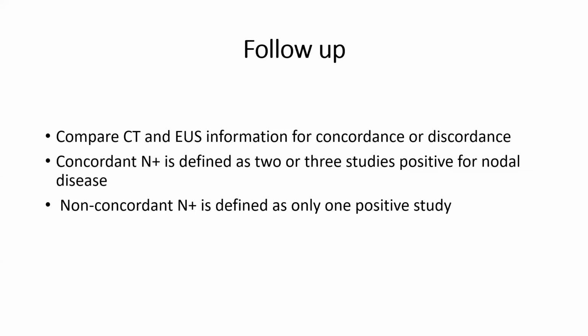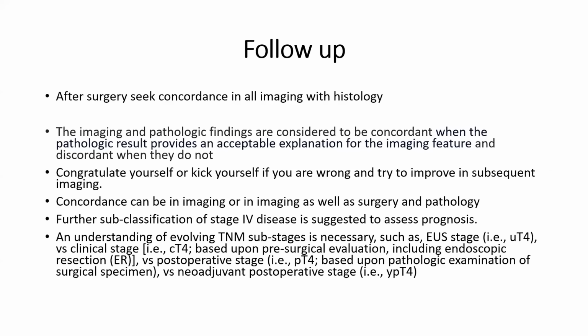Concordance is defined as 2 or 3 studies positive for nodal disease, and non-concordant is defined as only one positive. The question is, who is going to win, me or the CT scan person? Because ultimately, the judge is the histopathological report. We have to follow up. And as I said, I put tremendous emphasis, at least in surgical cases, on seeking concordance. And this is concordance. So you congratulate yourself, or you kick yourself, you are wrong. And you try to improve in subsequent imaging, because unless you try to improve, there is no way you are going to provide better results. I will elaborate later that it is important to improve upon yourself, to improve your staging if you are doing T2 staging. So these are some cases.